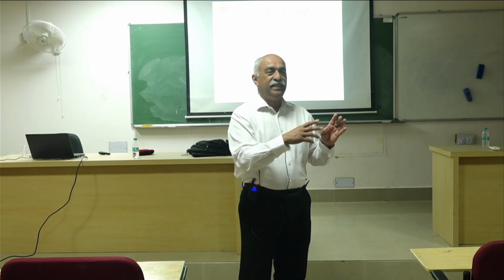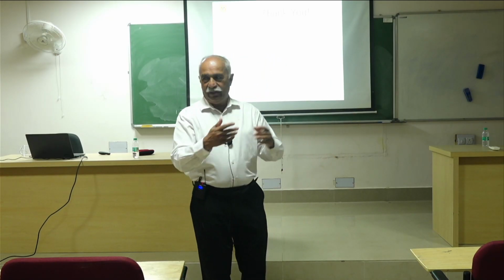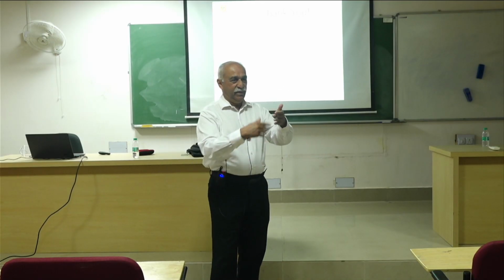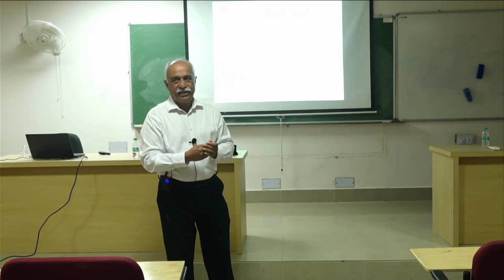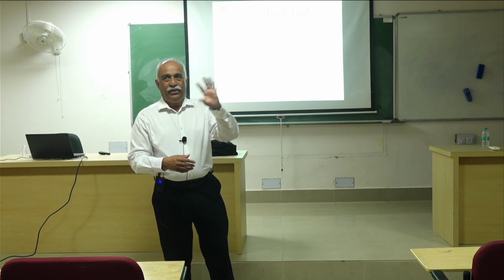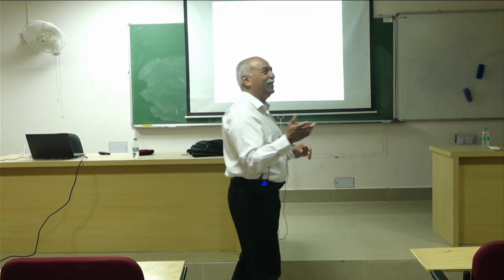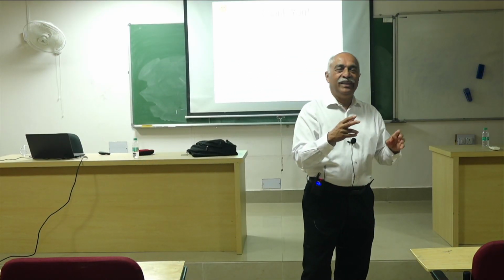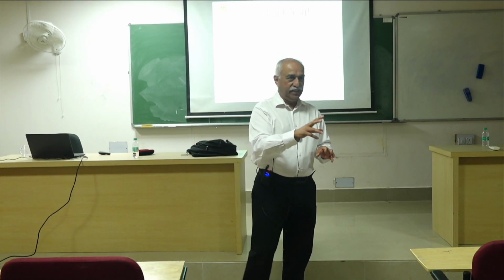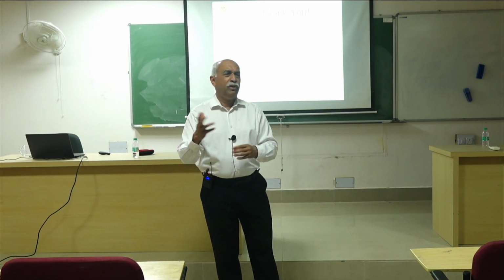So from that system, you take your pictures out, the radiologist will view on a monitor, and we get the digitized images and we do the image processing. So that is one. AI has nothing to do with it, I don't want to use AI. CAD has nothing to do with PACS and DICOM. They are just tools to facilitate the operation of the diagnostic enterprise, computer or radiologist.